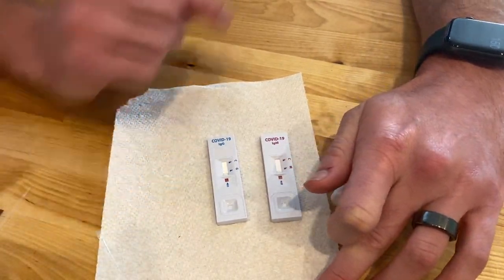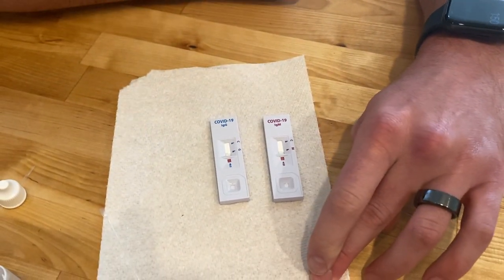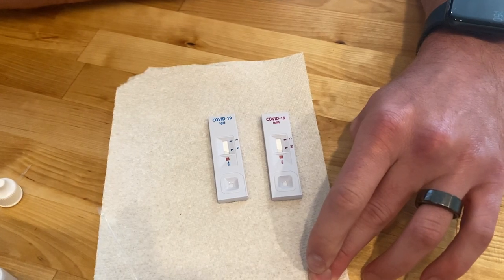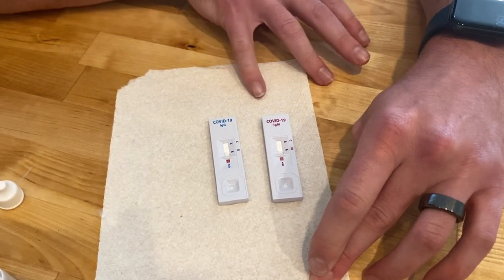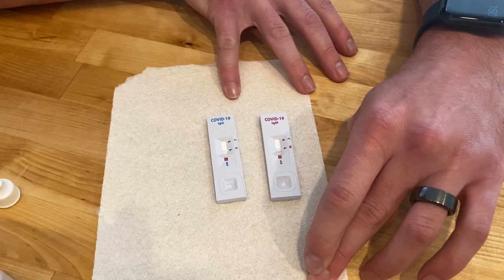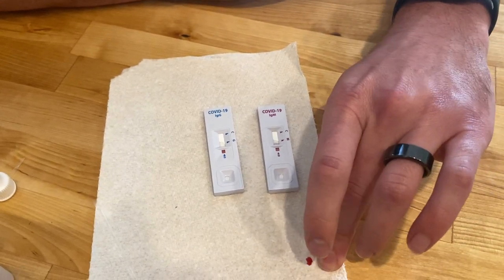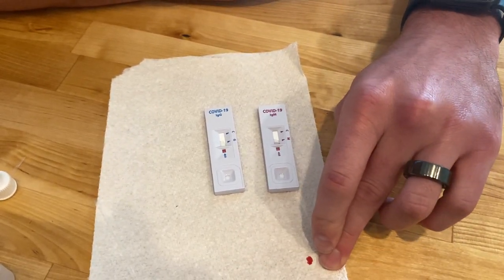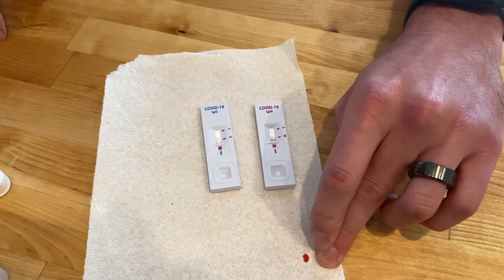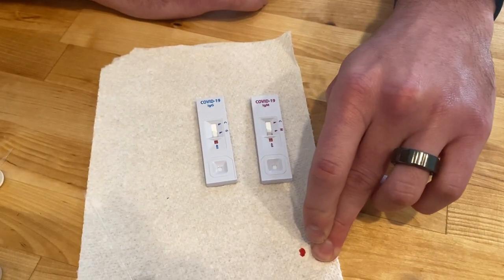In order to convey these results to us, you'll have a paper in your packet that will have a number to text. You will send a picture of the results after 15 minutes to that number with your name and date of birth. This demographic information will be used for reporting purposes only so that we can log your results. The instruction packet that comes from Wild Health with this test will have all those details on it, so please refer to that if you have any questions.